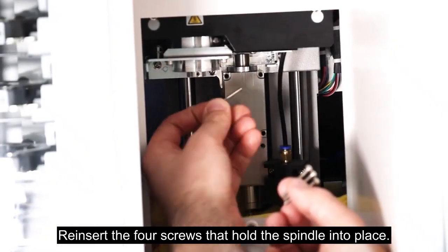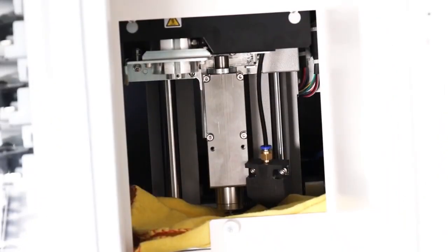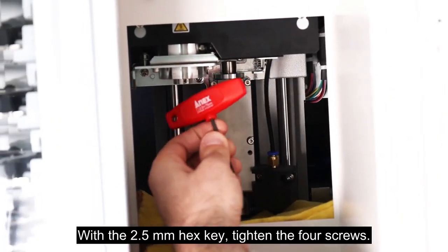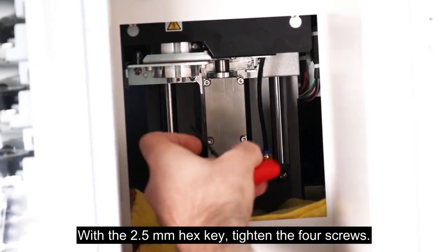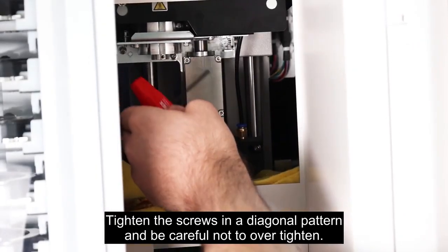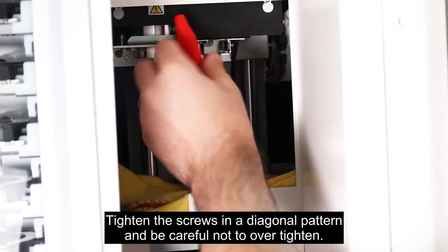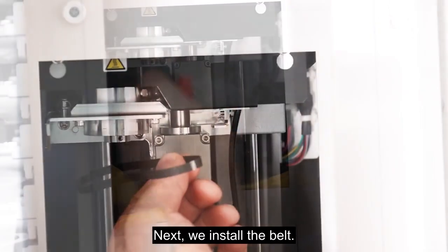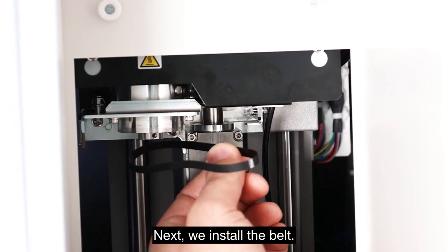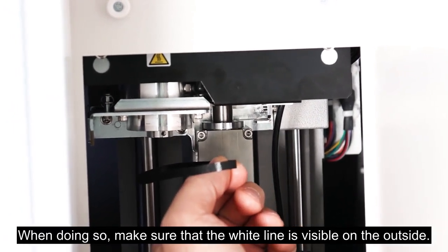Reinsert the 4 screws that hold the spindle into place. With the 2.5mm hex key, tighten the 4 screws. Tighten the screws in a diagonal pattern and be careful not to over tighten. Next, we install the belt. When doing so, make sure that the white line is visible on the outside.